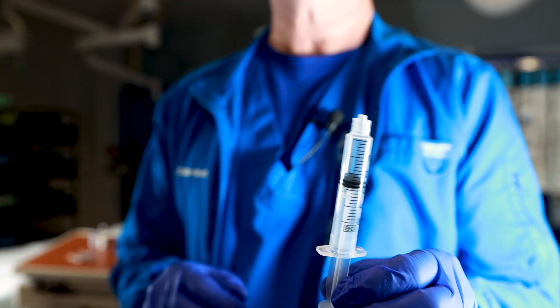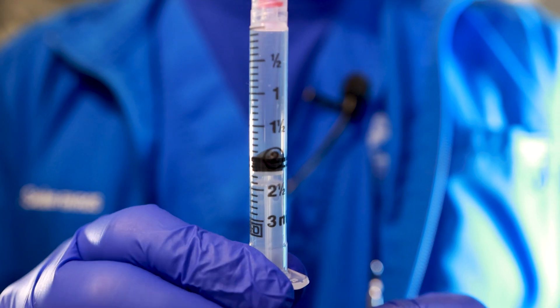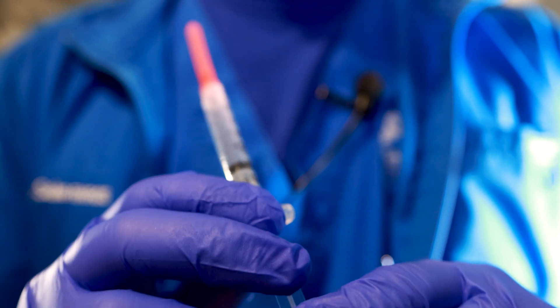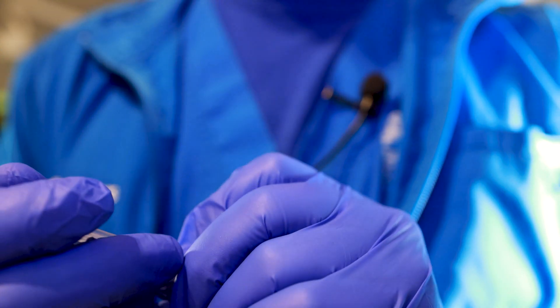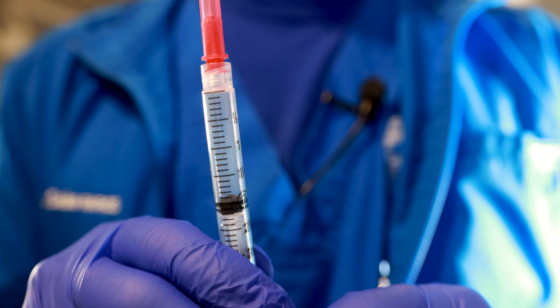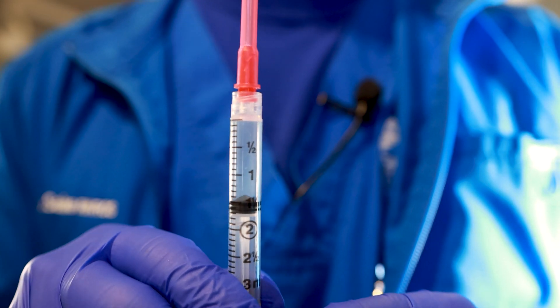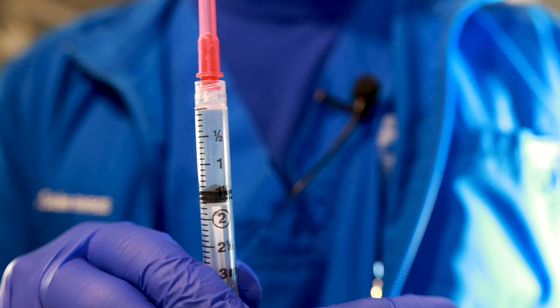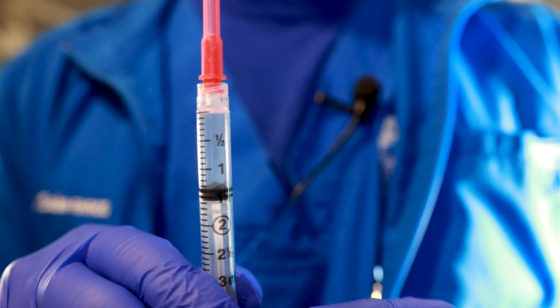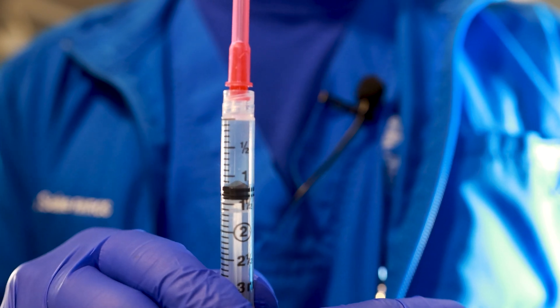There's nothing in here, just air — and by the way, air and fluid look the same. What I want to use is a three cc syringe. It's much easier to draw up. Let me check that I'm at the two cc mark. So if I had to give a half a cc or a quarter of a cc, it's much easier to do with a three cc syringe.